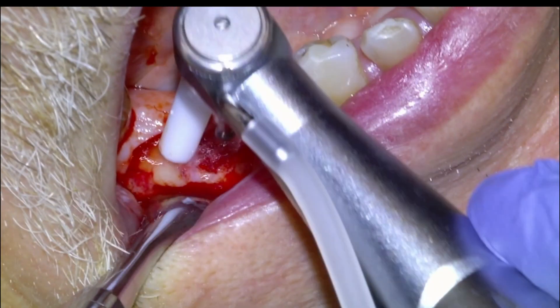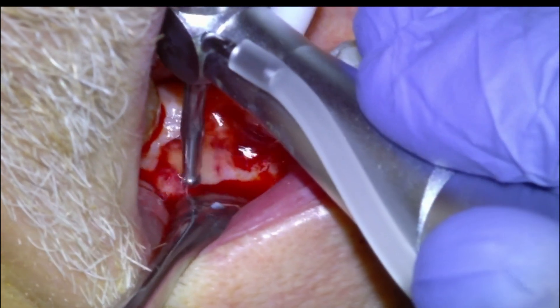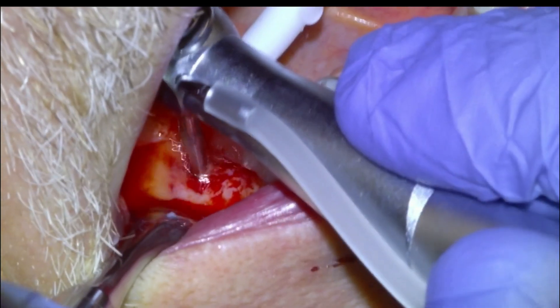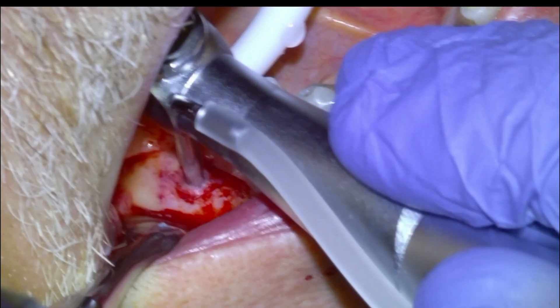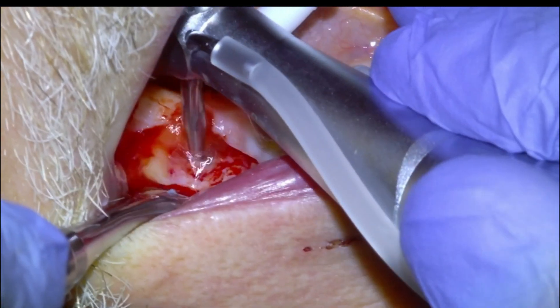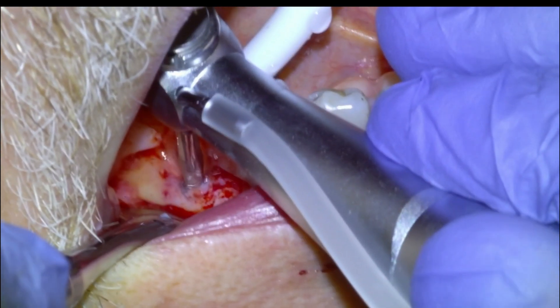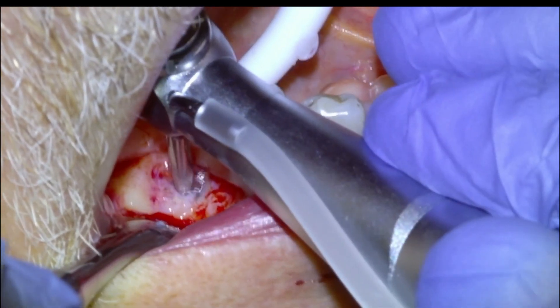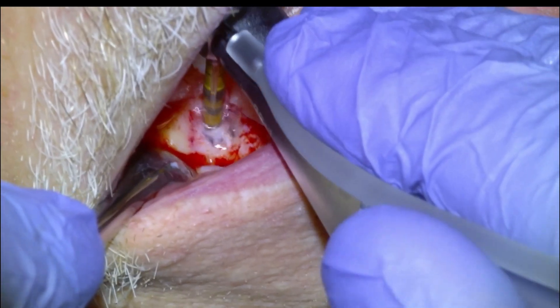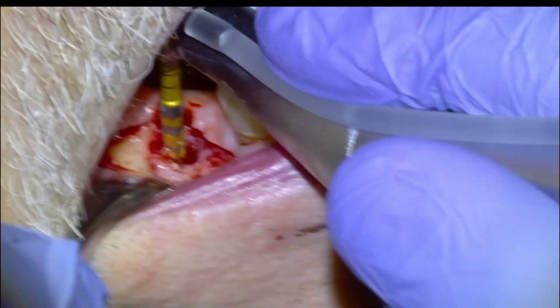I like to take a round burr first, feather the site, and then punch a hole right in the middle where we put our tissue punch. I'll usually take that down about 6 millimeters or so. You can see the bone is pretty soft and osteoid-like — kind of a combination of soft tissue and bone — but that'll all get opened up as we do our osteotomy. We'll take the round burr in with freehand measurements and then get started with our Versa burrs. All that soft tissue is going to get augered out as we open up the osteotomy.